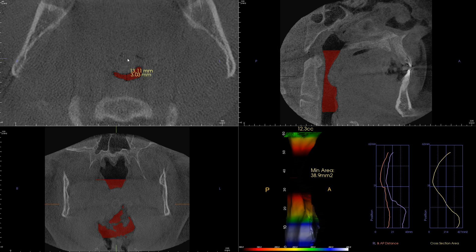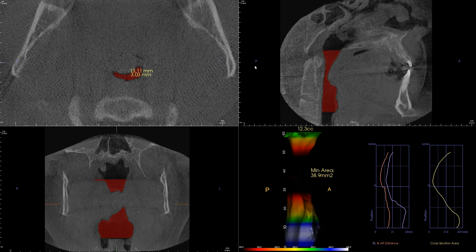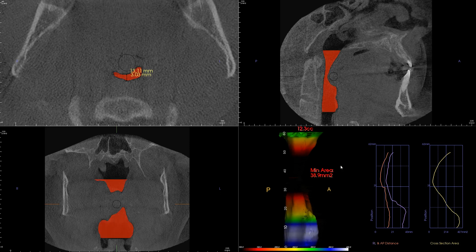Another area I want to focus on: observe that the position of the tongue is retreated — as a matter of fact, it's touching the roof of the mouth. There is a little bit of a gap, but this patient has lifted the tongue up and it's touching the roof of the mouth. That may have certainly contributed to this constricted appearance. Nevertheless, I am very concerned with such a small minimal cross-sectional area, and I have a suspicion for obstructive sleep apnea in this patient.